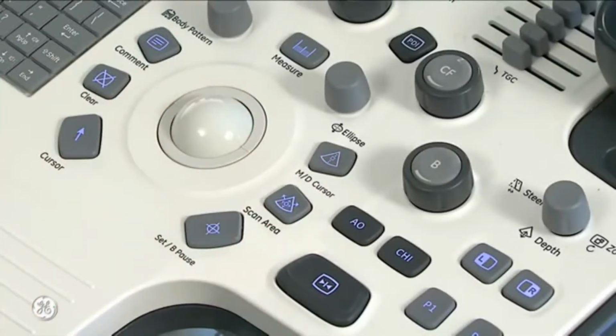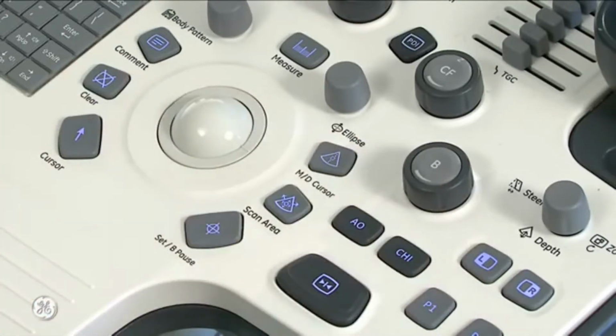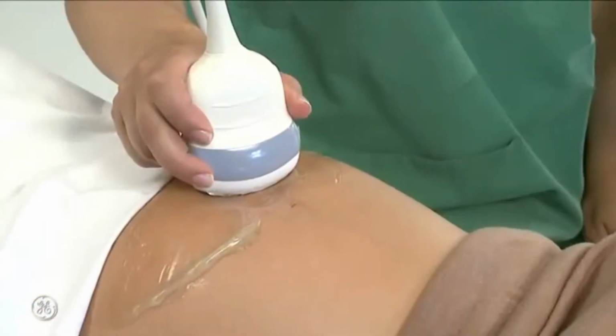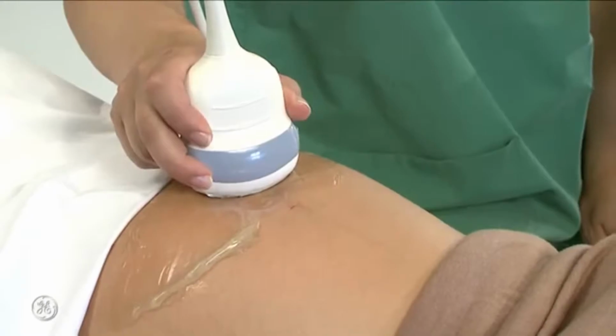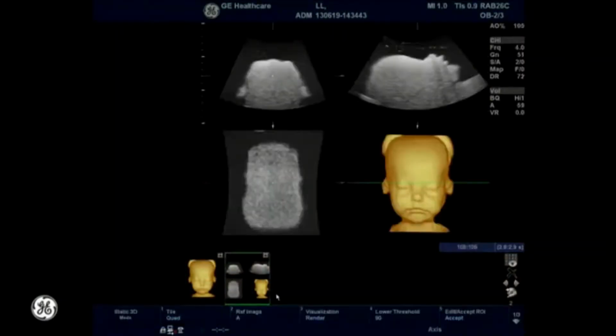To start the volume sampling, click the left button of LR on the control panel. The entire duration of the sampling process is approximately 3 to 4 seconds, depending on the imaging and region of interest settings. During this time, you must keep the probe steady on the anatomy.